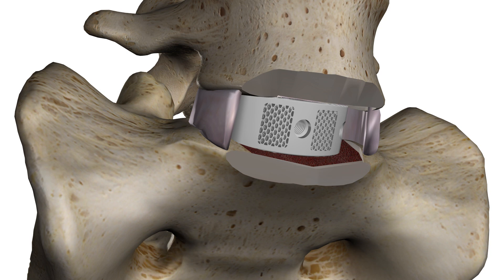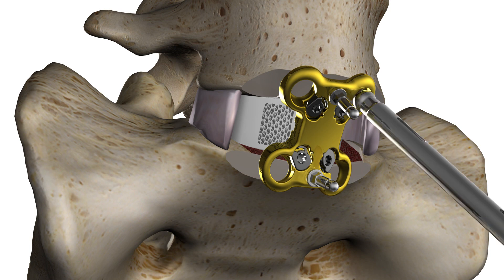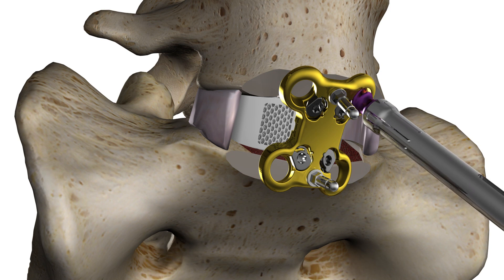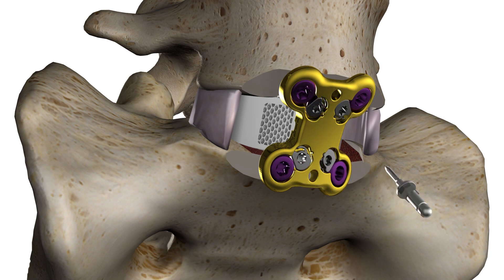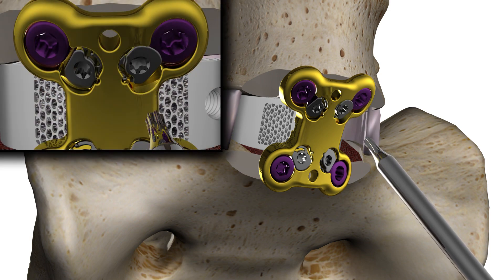Zoo Plate size is determined by using a trial. The plate is applied and temporary pins are used for fixation. The awl is used to prepare screw holes prior to placement. Once screws are inserted, the temporary fixation pins are removed and the locking driver is used to prevent screw back out.